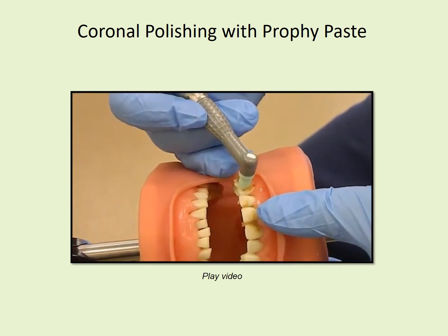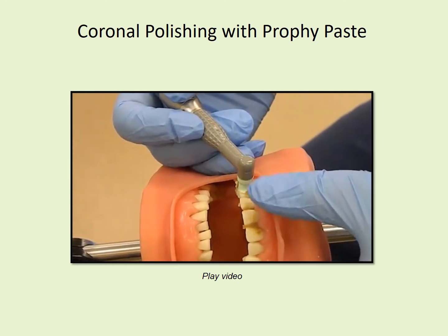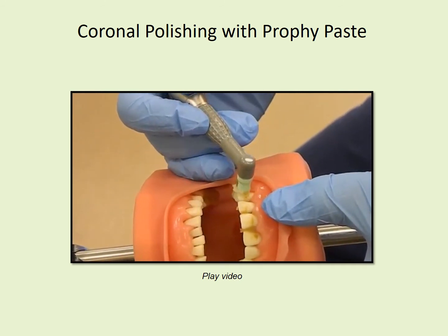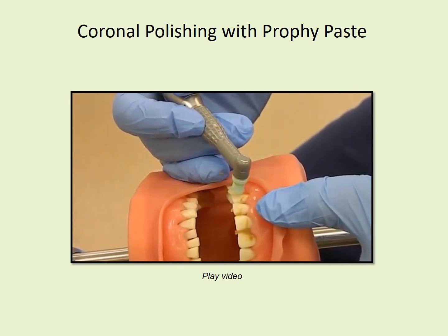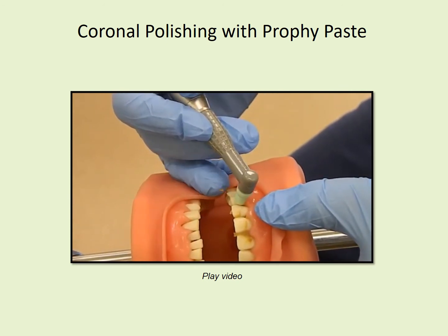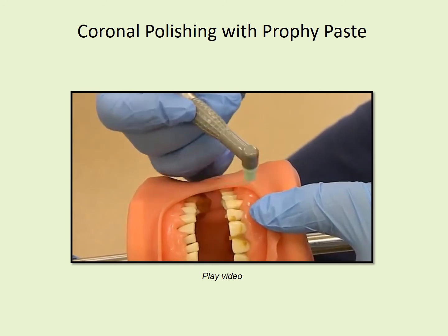When you're pressing the cup against the tooth, you want to flare the cup toward the gum line, like this. So I'll show you one. And then you want to make sure that cup flares into the interproximal space.